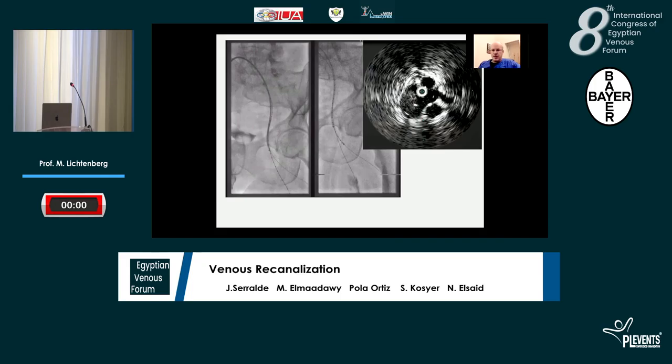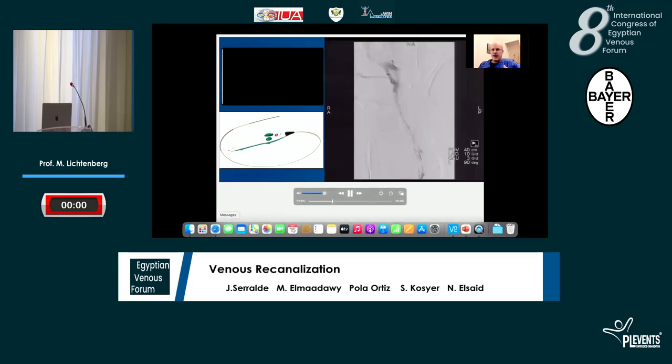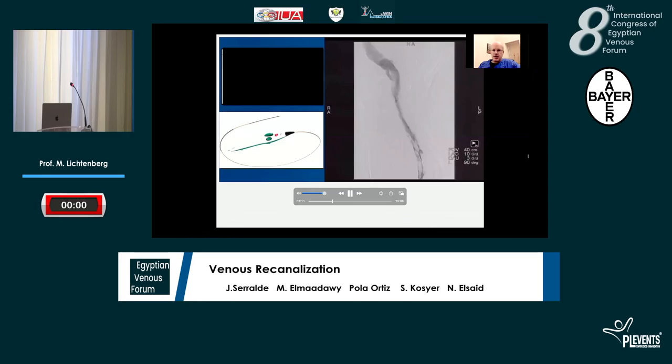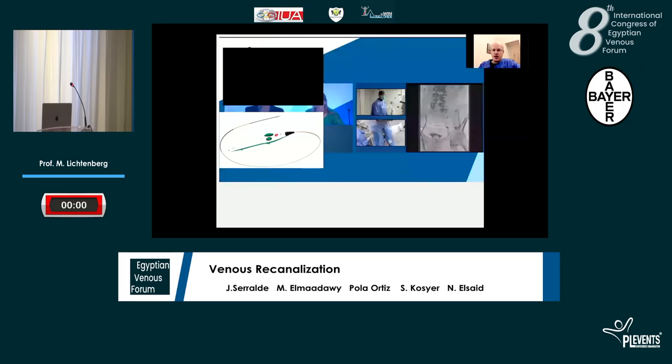I think this is something we definitely need to do in a multidisciplinary approach, together with vascular surgeons and endovascular specialists. Here you can see that after implanting Venovo stents from the profunda vein upwards, you can improve this inflow. Especially in patients with severe post-thrombotic syndrome, you can avoid opening the groin and creating problems like wound healing issues in the groin after interventions. This can be done in venous centers nowadays, and it gives more hope for patients, especially with these severe stages.